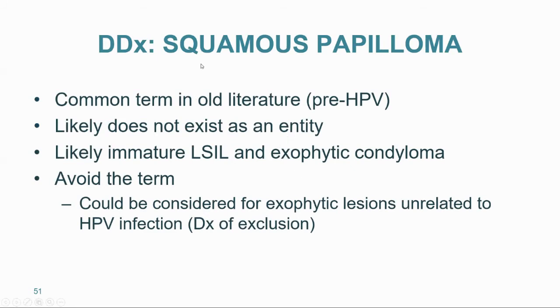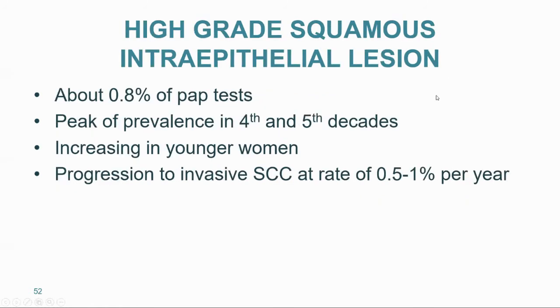I mentioned the term squamous papilloma before because it was common in the old literature, pre-HPV era. I don't think it really exists as an entity because most exophytic or papillary or condylomatous lesions in the cervix are indeed related to HPV infection. So I would avoid the term, because squamous papilloma is something that we would understand in other anatomic sites as independent from HPV infection.